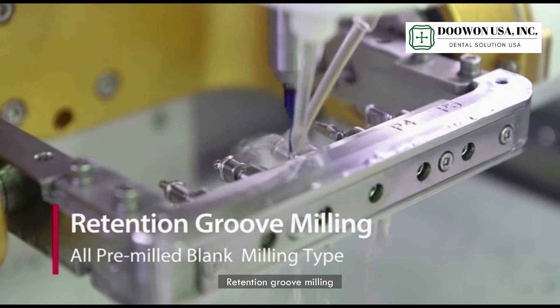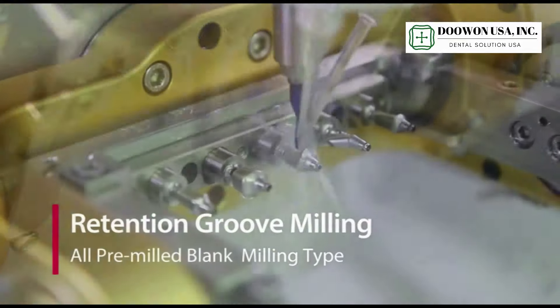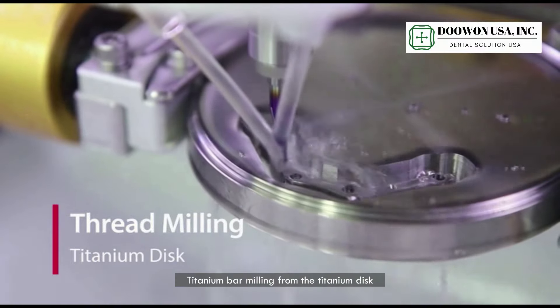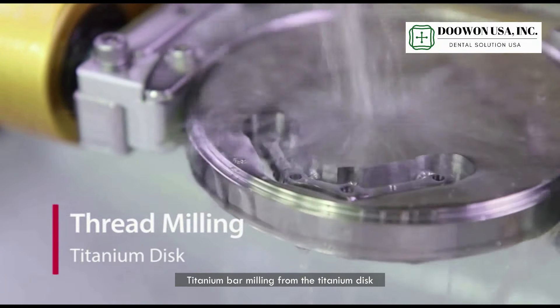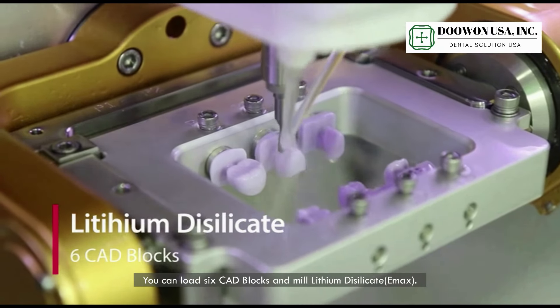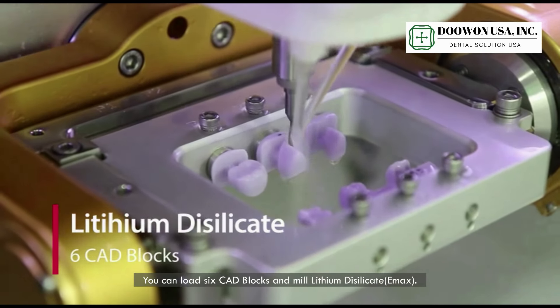Retention groove milling, thread milling, and titanium bar milling from the titanium disc are all supported. You can load six CAD blocks and mill lithium disilicate.